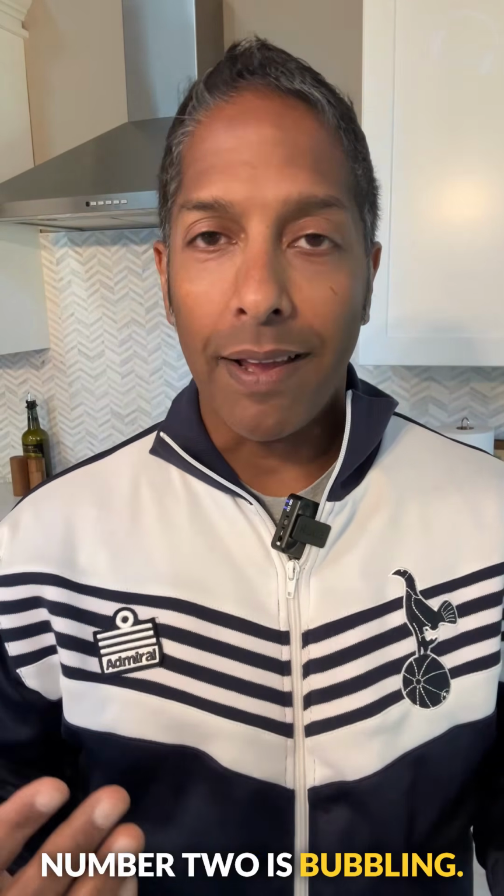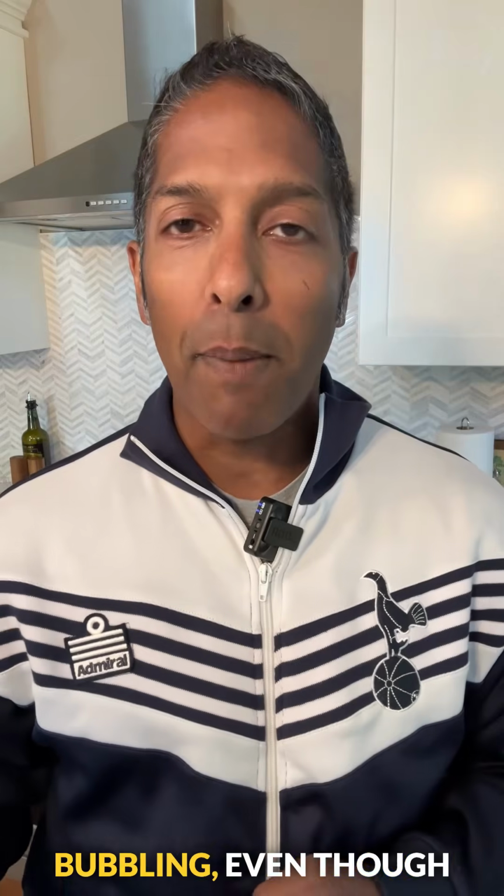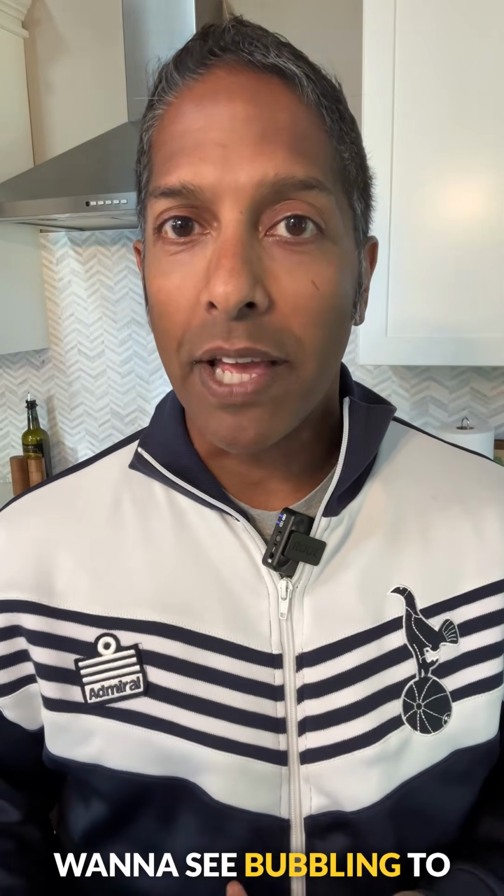Number two is bubbling. You want to see air bubbles in that water-sealed chamber if you are draining a pneumothorax with that chest tube. Down the line, if you have continued bubbling, even though the pneumothorax should have resolved by then, it tells you that you've got an air leak. That's something for people to manage down the line. But for us, we want to see bubbling to tell us that we actually put the chest tube into the pneumothorax.